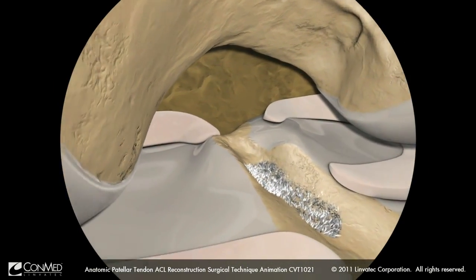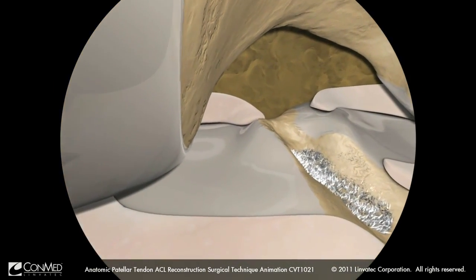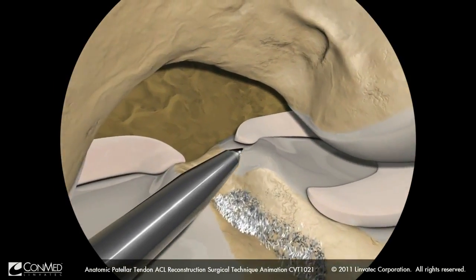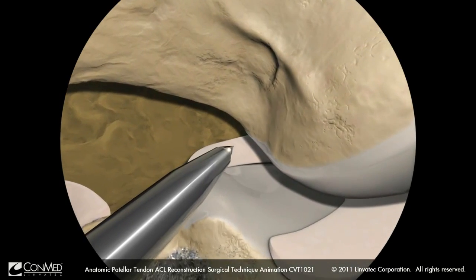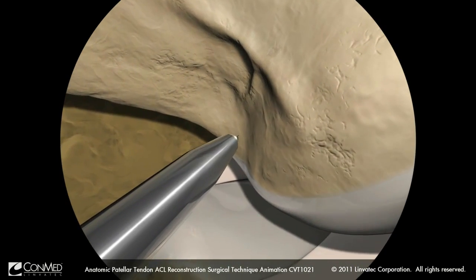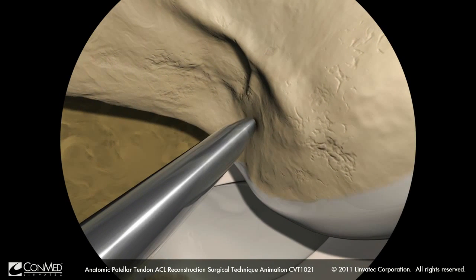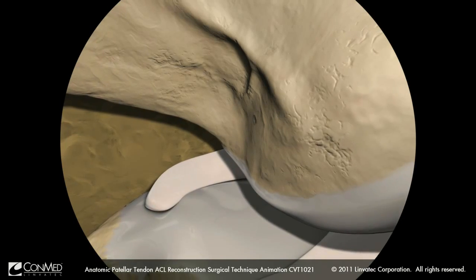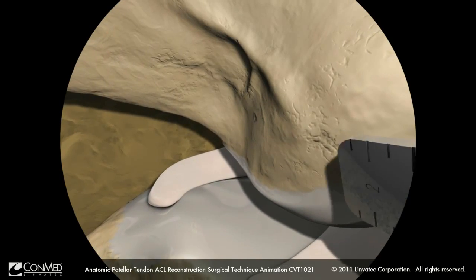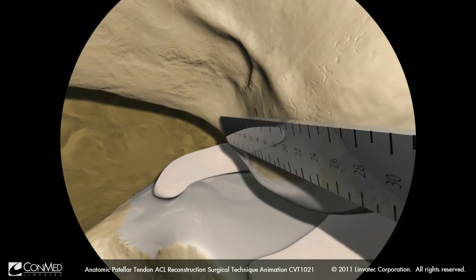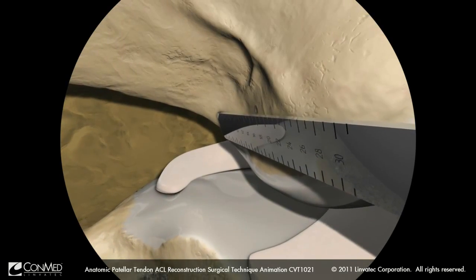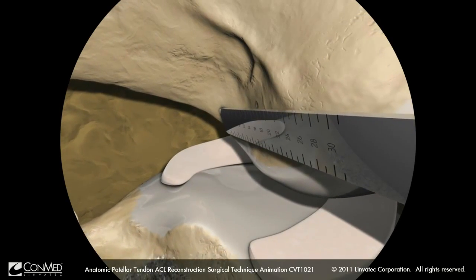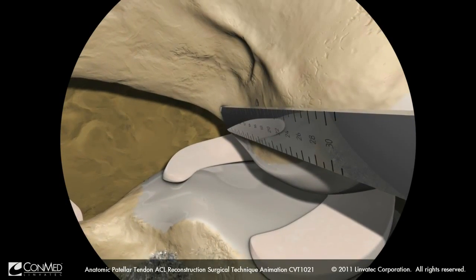Switch the arthroscope to the anteromedial portal. Mark the center of the femoral ACL footprint using a microfracture awl. Once marked, use the bullseye native footprint ruler to assess the footprint of the native ACL stump.